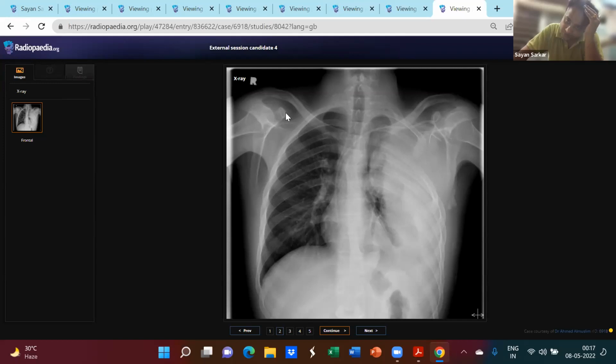Yeah, that is one thing. It does not appear to be a dialysis catheter. No, this is a central line only. What do you think has happened to the patient?